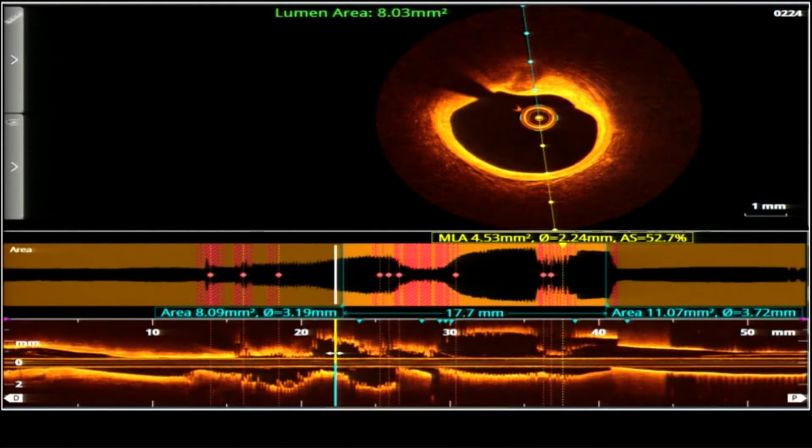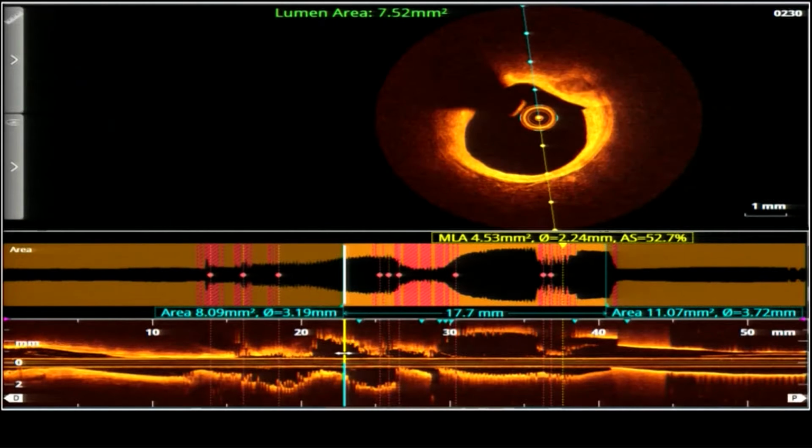By the way, in between, any suggestions regarding the imaging modality, IVUS versus OCT, in this type of situation? Yeah, Umeshan, it's a very interesting case. There is a very significant lesion in the distal left main. And angiographically, we feel that the ostium of the circumflex and the LAD is not diseased. That is what I could interpret.